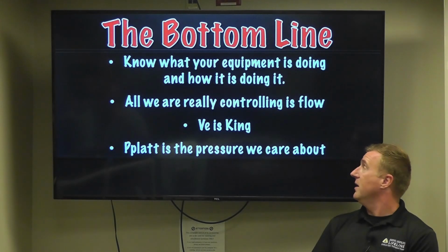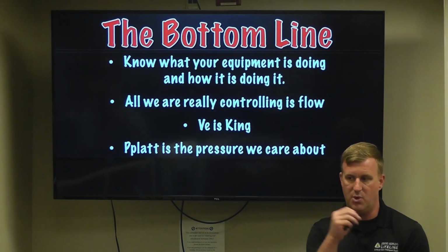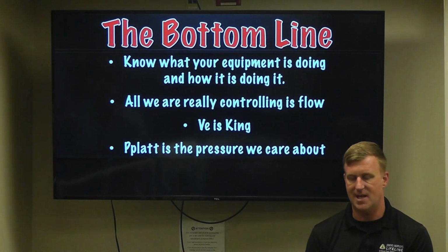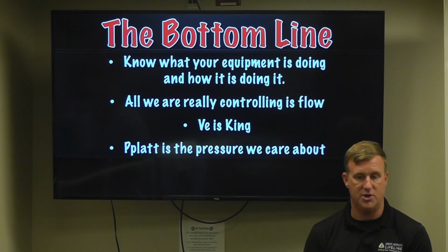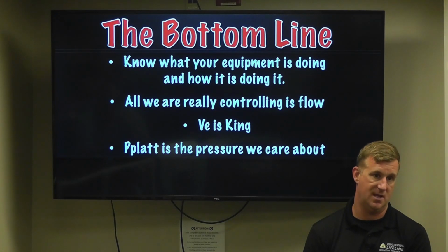And then all we really are doing is controlling flow, right? What we control is flow, and understanding pressure versus volume and how we can utilize that to accomplish our goals is really important. An example of that is if you're ventilating a CHF patient that has full flash pulmonary edema, or you're ventilating a post-drowning, pressure is your friend there. They've got a bunch of crap in their lung or between their alveoli and that vascular bed, and pressure is going to help you push that gas across that alveolar membrane.